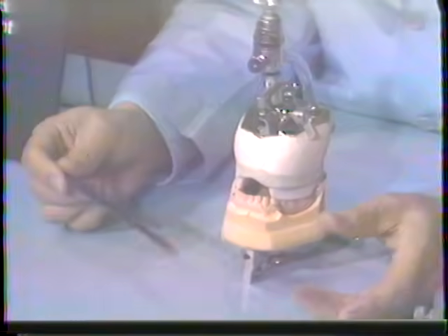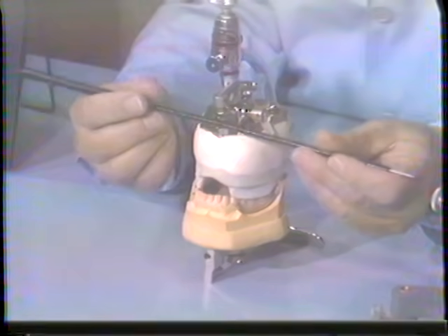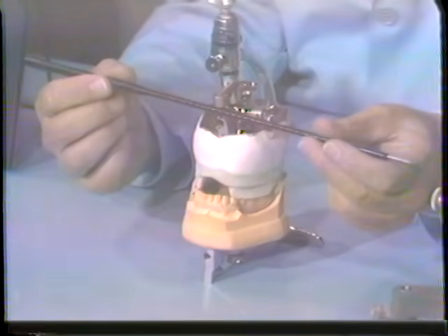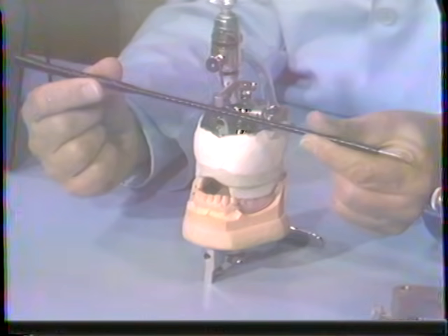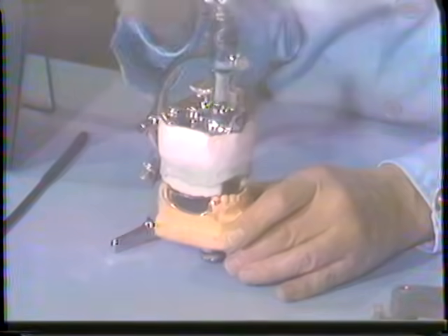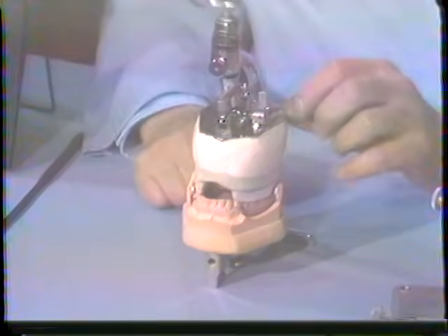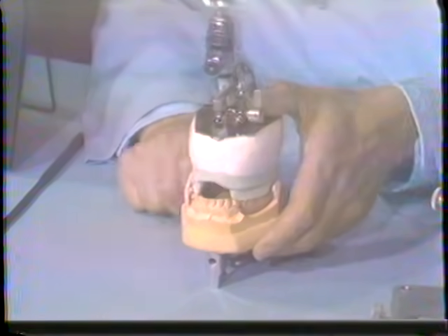For this particular instrument, we don't have the equipment here, but there is an additional feature that can be added to this instrument, and one can make a facebow transfer on this instrument too. But we did want to bring up the generated path procedure because it is a fine procedure for tracing out in the mouth actually the paths of one arch of the teeth into the occlusal wax, which can be used in the opposing arch.